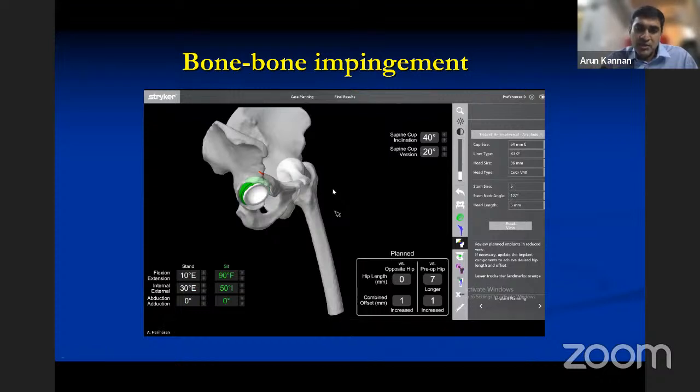So when the acetabular and femoral positions are fairly well aligned, this is what we are seeing more often because we've managed to correct the acetabular and femoral versions. Then this is the component that remains, despite having a good offset and length correction. This is the impingement pattern. So what would you recommend doing in this scenario when there is external impingement with length and offset restored?